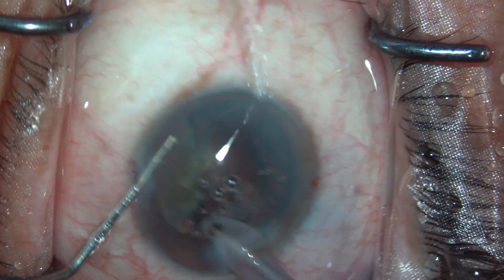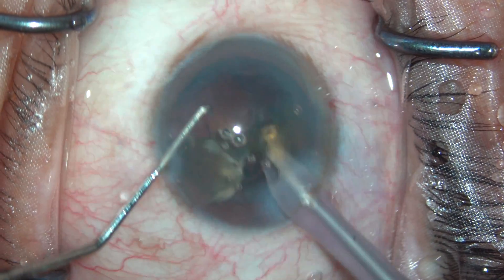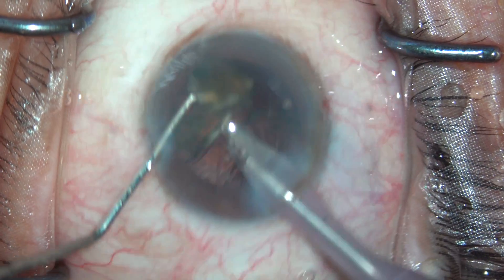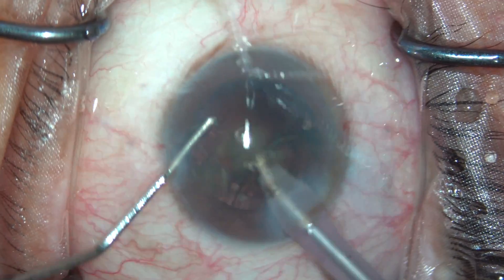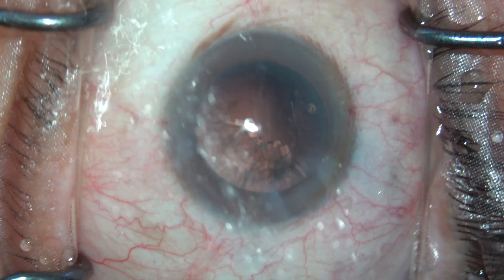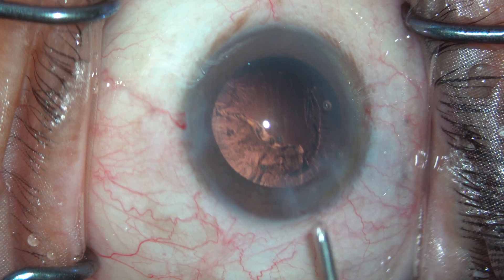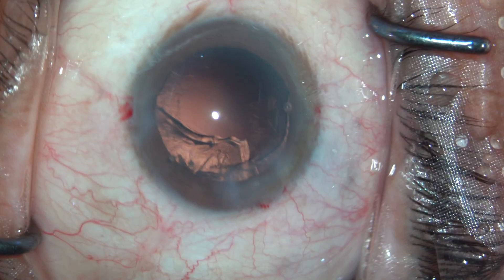The last piece of the nucleus is left, and that was also rotated and eaten up using the phaco. The phaco part is done. Putting some HPMC again into the anterior chamber.